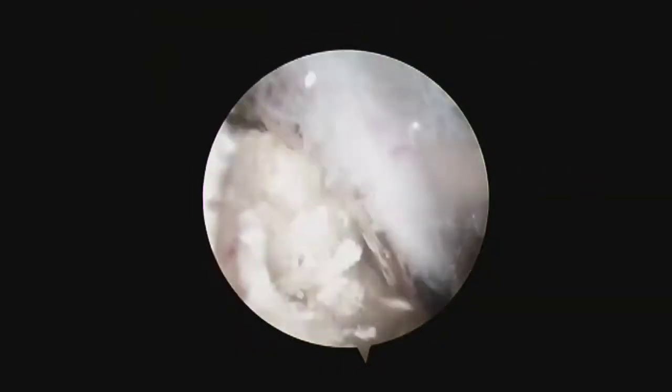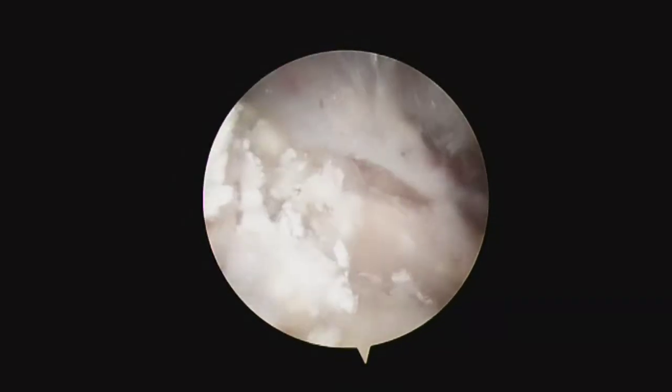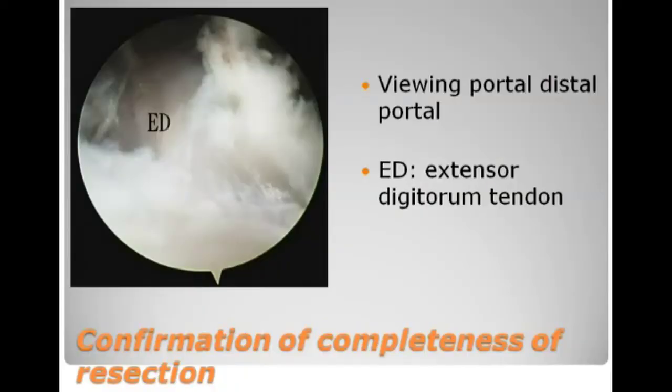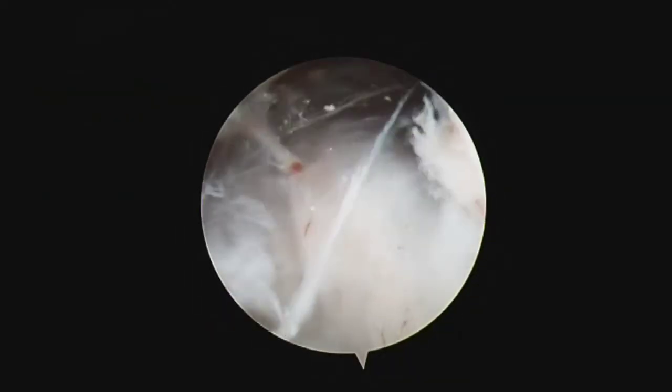After this, the tophus material adherent to the surface of the tendon is removed by means of an arthroscopic curette and an arthroscopic punch. After that, the tendon is examined for any residual tophus material.